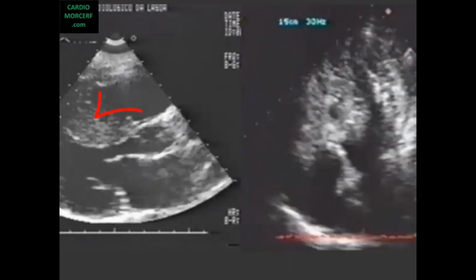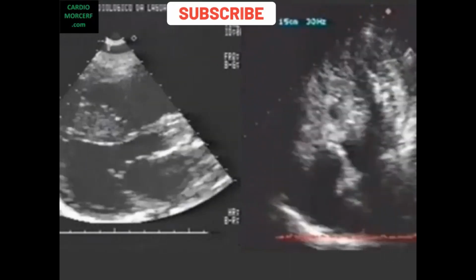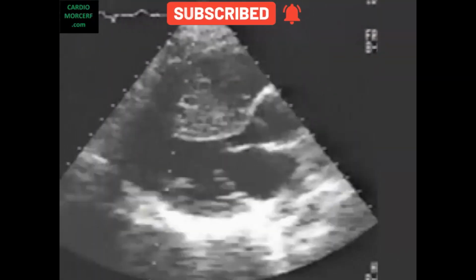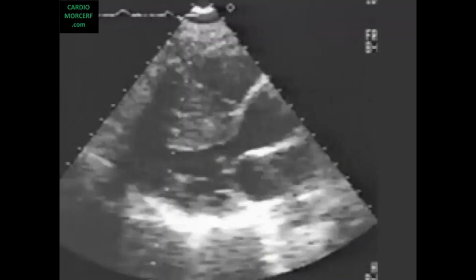The IVS granulation may be mild or intense. Occasionally, we see a line of greater refringence right at the middle of the IVS. This is not a rare appearance. The IVS seems to be divided into two sides.